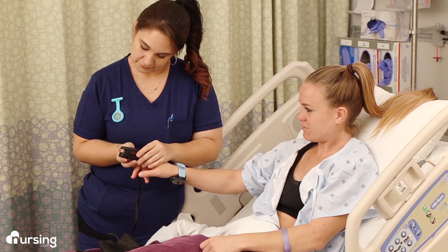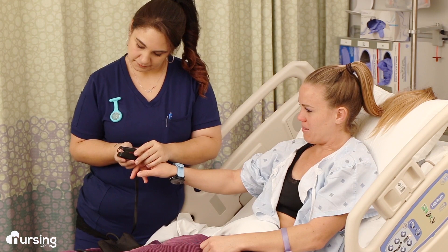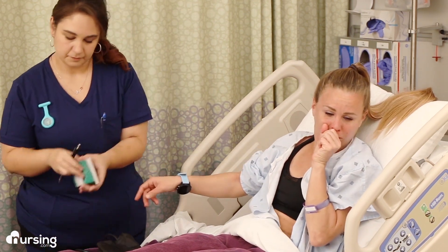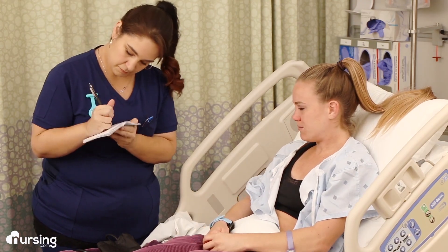That's the number you're going to document. If you're still having trouble with circulation, you can try a different hand, a toe, or even probes for ears and noses as well. Last but certainly not least, document your vital signs.